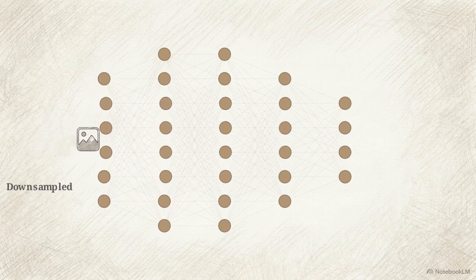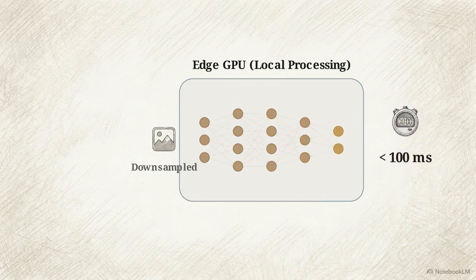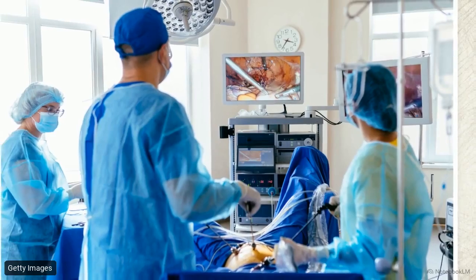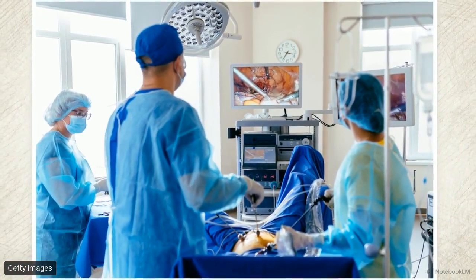Engineers must balance strategic input downsampling and heavy model compression just to force massive transformer models onto edge GPUs. The evolution of surgical data science hinges on compressing immense logical capabilities into the physical constraints of the operating theater to objectively safeguard patient life.